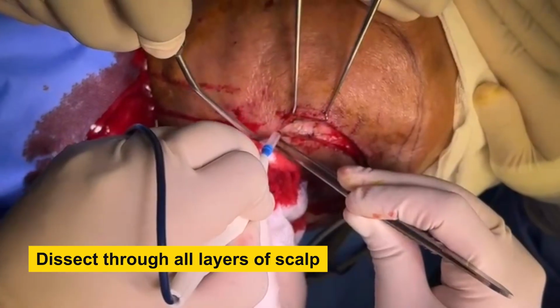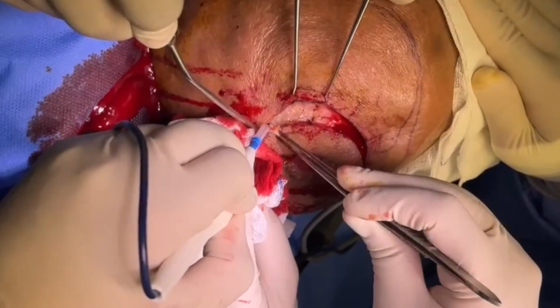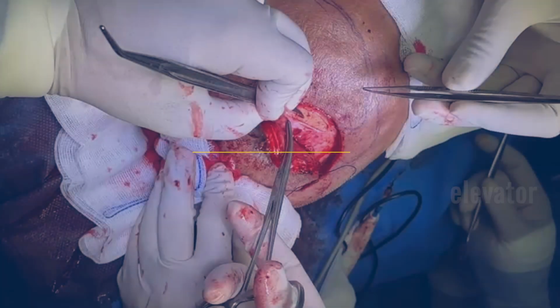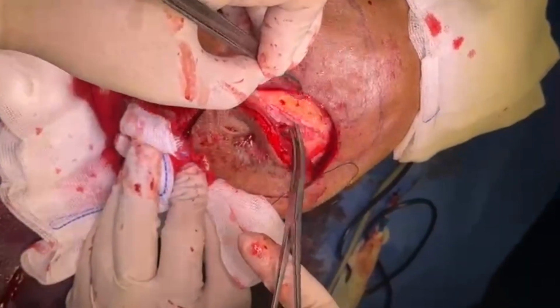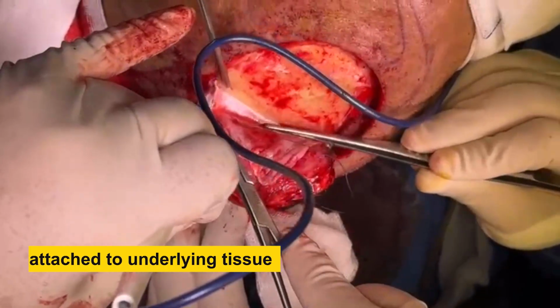Dissect through all layers of the scalp and get to the periosteum at least on 1/3 of the lesion. Cut periosteum with blade and elevate it with the periosteal elevator all the way to the other margin of excision. While elevating, also make sure that the tumor is not attached to the underlying bone.